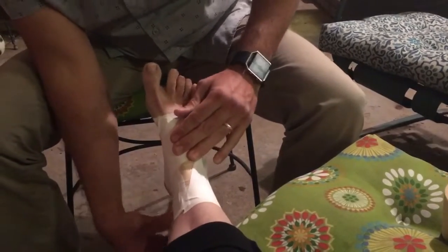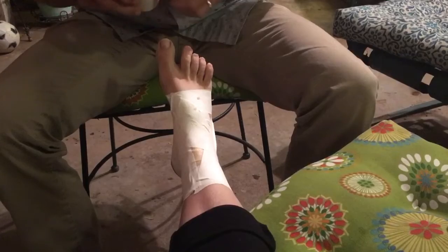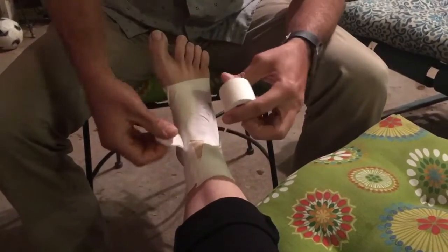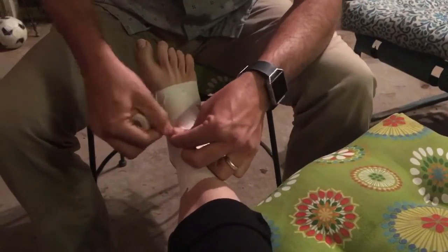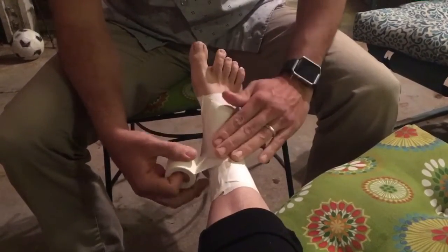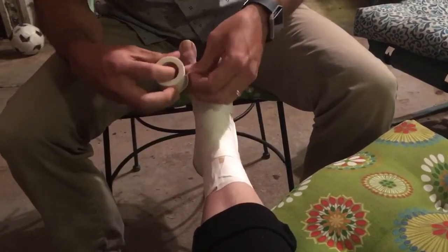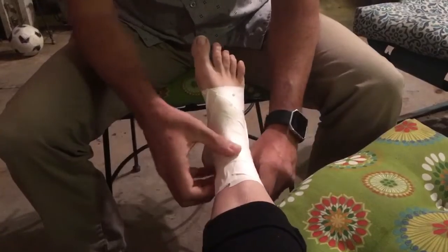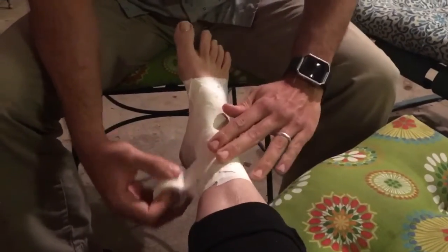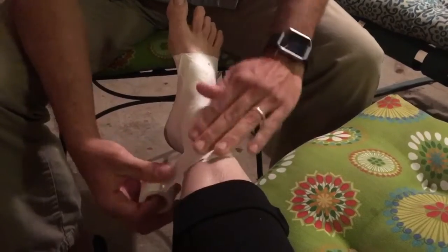So we've applied 3 stirrup straps. This is our 3rd horseshoe strap. Now we're going to continue to go around and clean this up, taking as best care as possible not to have any creases or wrinkles in our tape, so that we can avoid blisters or excessive irritation. And it is okay that this initial taping is a little bit tight, because as the athlete moves around with it on, it is going to loosen up a bit and does still allow for range of motion, slight range of motion to take place.